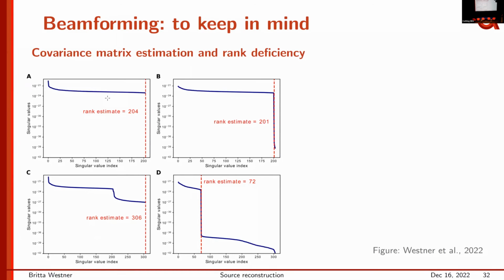You can't get it back. I kicked it out. So no matter what subspace we are in, this information is missing, and we are short by 3 components, meaning we are rank deficient by 3, meaning a natural inversion of a covariance matrix from this data does not exist anymore.